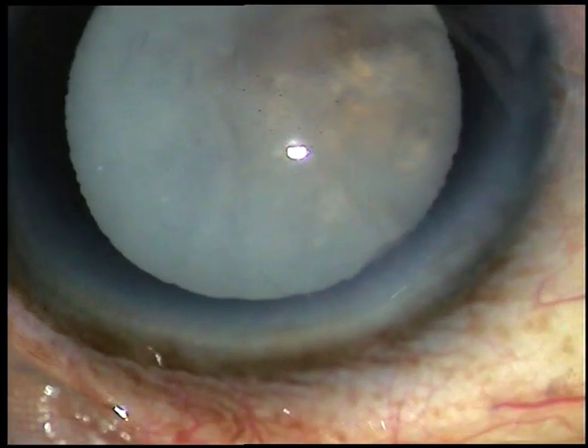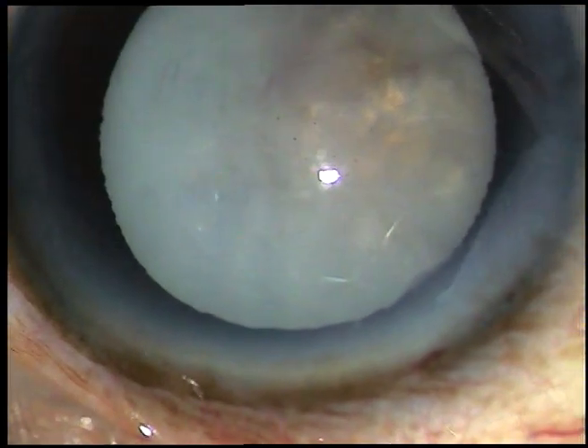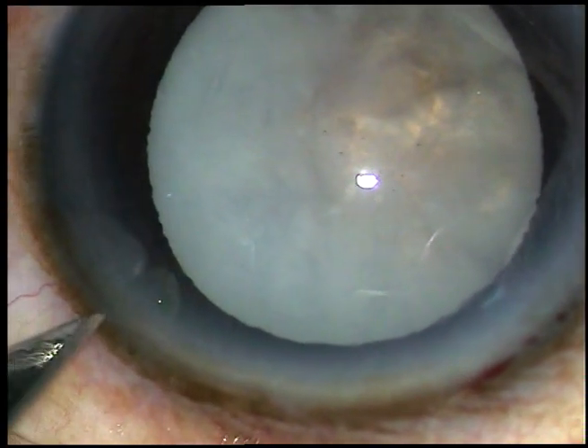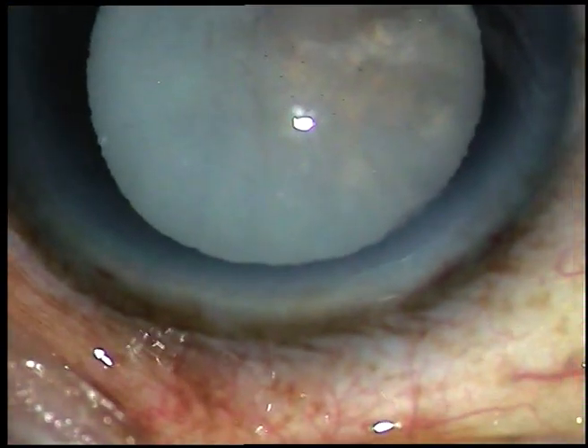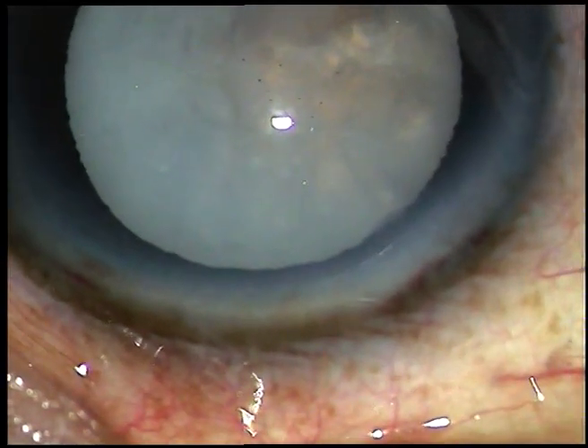This is the main incision — it is a 2.8 mm incision. This is a side port on the left side of the main incision. In this case, I have made only one side port, about 3 o'clock hours away from the main incision.